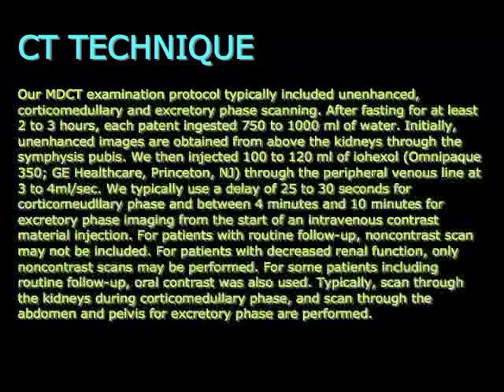In terms of non-contrast CT, its best advantage is that stones can be detected. But the truth is, with early phase imaging, I can see stones anyway. So to decrease radiation, typically a cortical-medullary phase and probably the delayed phase or excretory phase with CT urography is all that may be necessary.